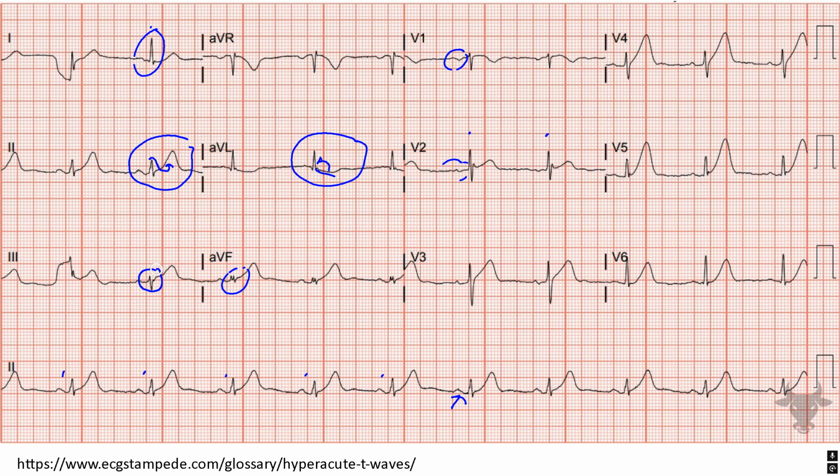Same thing here. This entire QRS can fit underneath this T wave. Same issue here, these T waves are taller than the QRS. Look as well here, look at these. Look how tall that is. Same issue here, that entire QRS is fitting underneath the T wave. Okay, global hyperacute T waves are most often associated with hyperkalemia, but focal hyperacute T waves can be a cause or concerning for infarction or ischemia, which I'm worried about as an ER doctor.